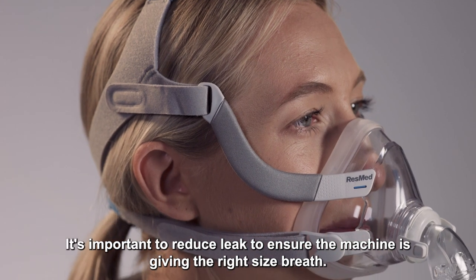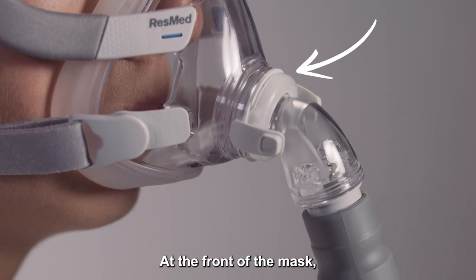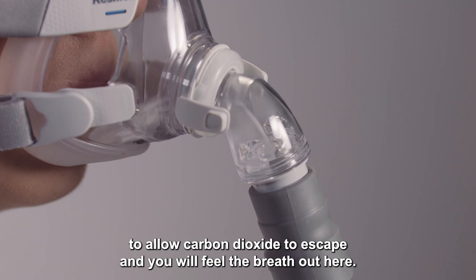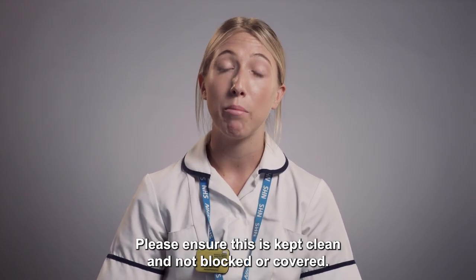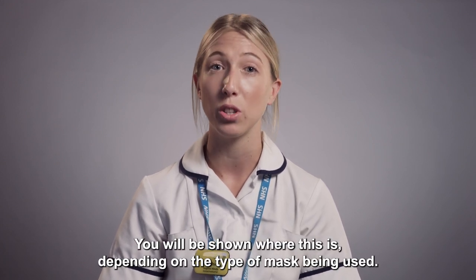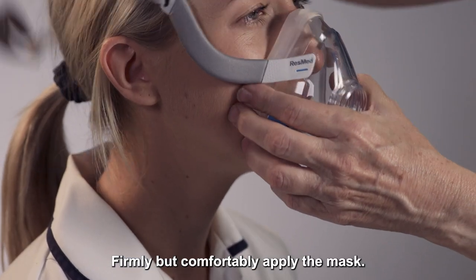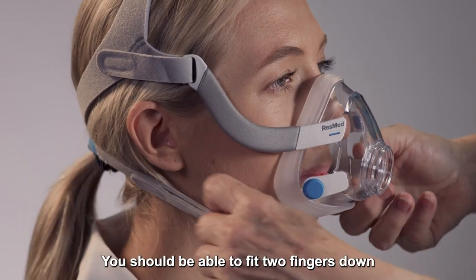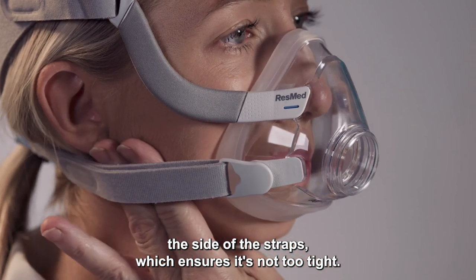It's important to reduce leak to ensure the machine is giving the right size breath. At the front of the mask, there is an exhalation port to allow carbon dioxide to escape and you will feel the breath out here. Please ensure this is kept clean and not blocked or covered. Firmly but comfortably apply the mask. This should sit on the bridge of the nose and in the chin groove. You should be able to fit two fingers down the side of the straps, which ensures it's not too tight.